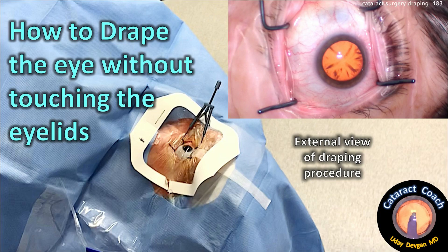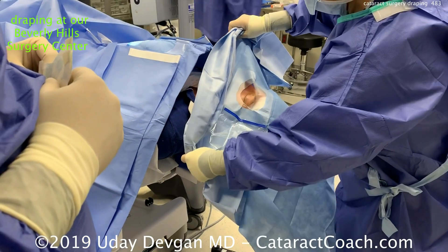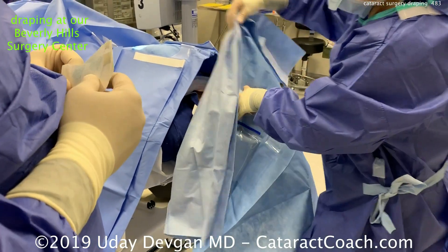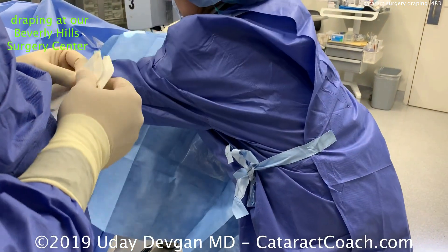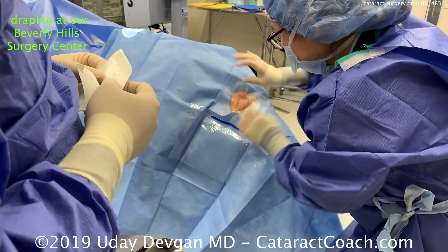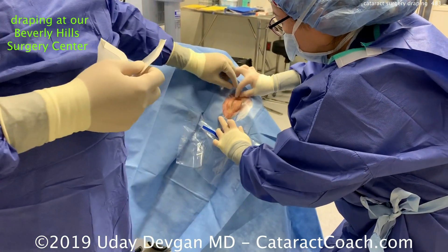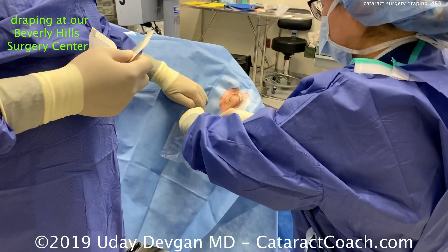CataractCoach.com: how to drape the eye without touching the eyelids for cataract surgery. Here's how we do it at our Beverly Hills Surgery Center. We place this first drape that has a cutout for the eye with adhesive — it sticks around the face, has a nice seal, and the eyelids are now exposed. We don't touch the eyelids; we're just touching the drape.